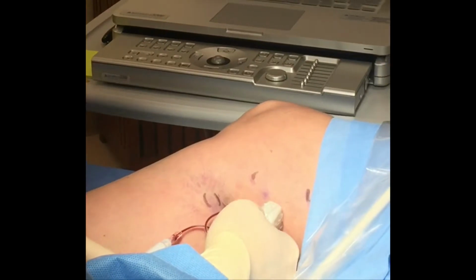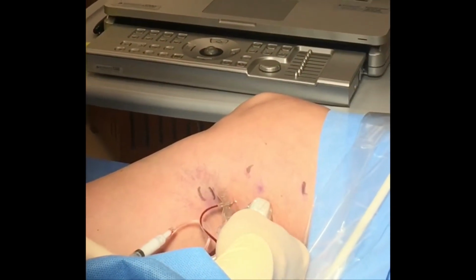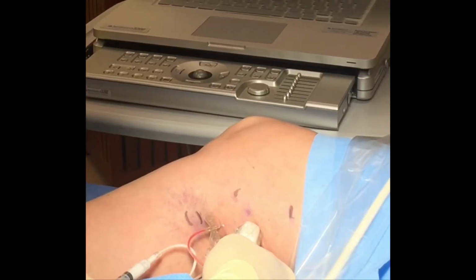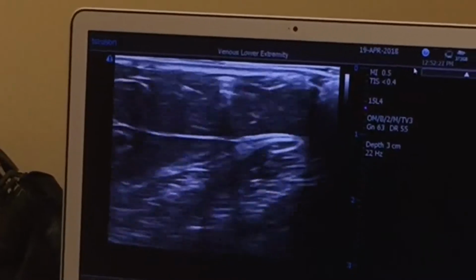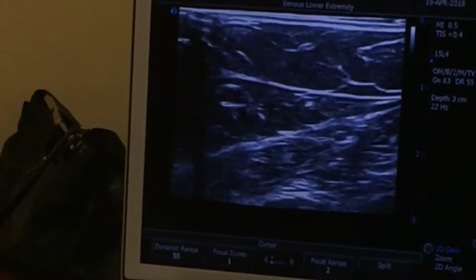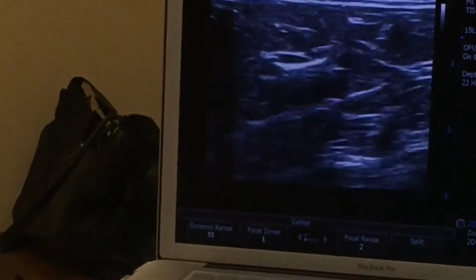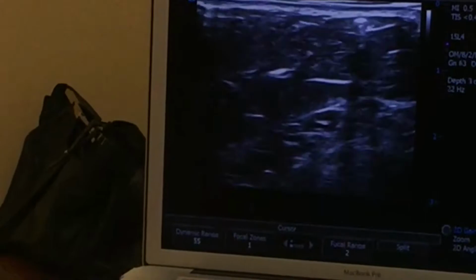Now we'll inject the foam. You'll see the foam go into the tubing, and you'll watch the vein at the top of the screen fill with the white speckles. Beautiful. Excellent. So that's the branch coming off the great saphenous vein there that was feeding that little patch of spider veins in the lower thigh and medial knee.